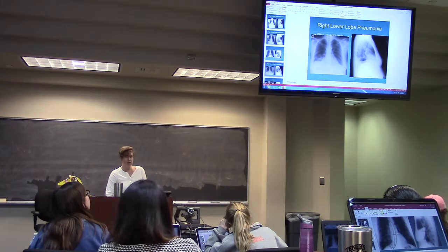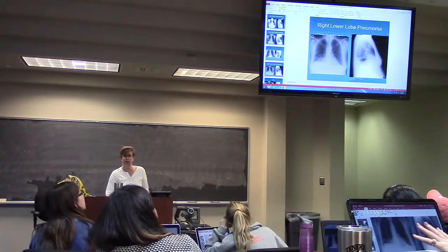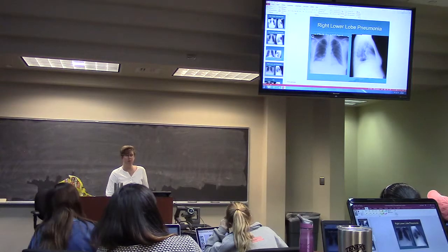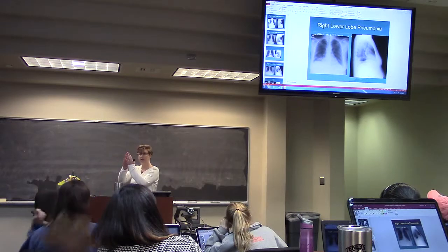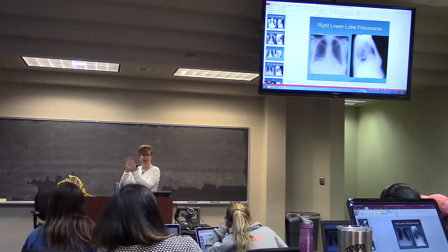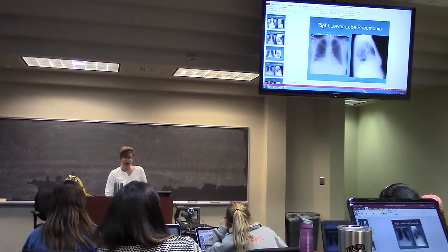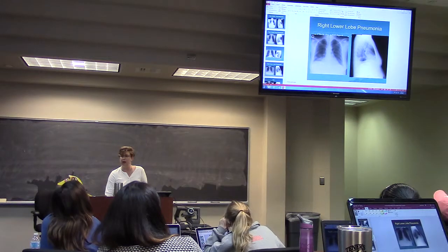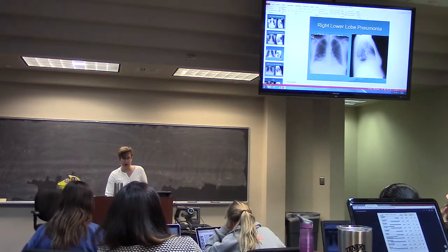Yes, I've lost my right heart margin, but I've also lost my diaphragm here. So I'm not sure exactly where it's at. Remember, I gave you guidelines, but they're not 100% because I have something that's three-dimensional. So I have to use my lateral and I go, yeah, the cardiac, there's no whiteness here, that looks really good. But remember how this is supposed to get blacker and blacker and blacker?